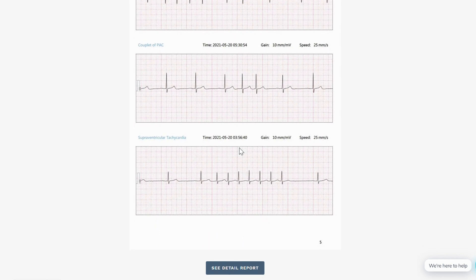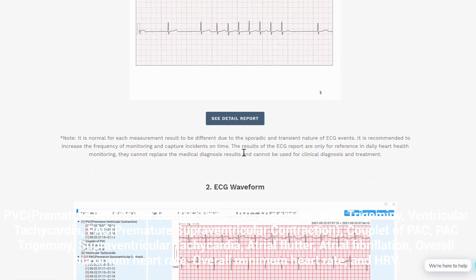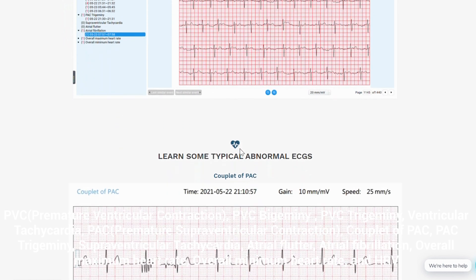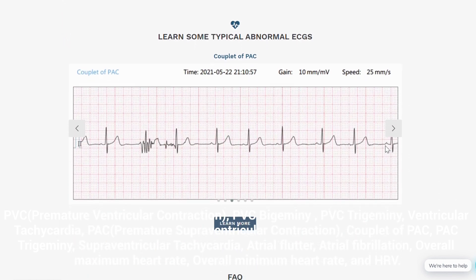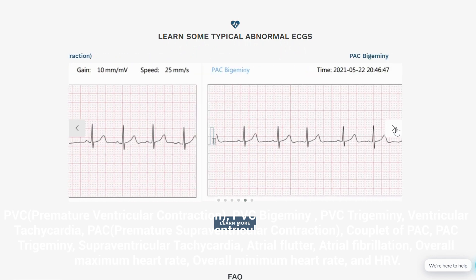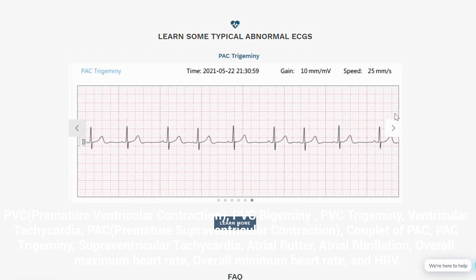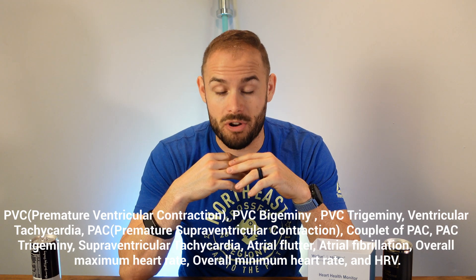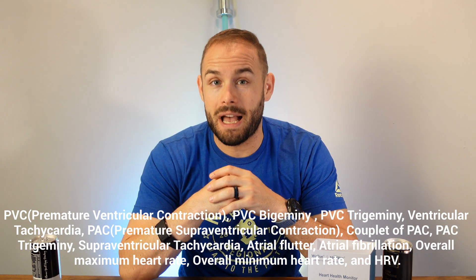I'm not really going to go into the full amount of events this can identify — I'll list them down below. It is a long list of things I would most likely mispronounce, but it can actually identify all of these things and let you know what's going on. Things I do know it covers include minimum heart rate, heart rate variability, and maximum heart rate as well.